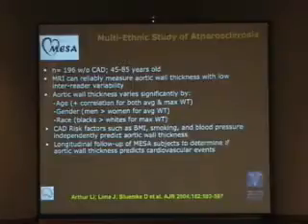So what are the findings? This is now in a setting that you want it to be. This is a multi-center setting, looking at subclinical disease, 196 patients, 45 to 85, showing that it's not only New York and Seattle that can do this, that MRI can reliably measure aortic wall thickness with very low inter-reader variability. And there's a wall thickness correlation with age, and it's interesting also with gender and race. That's one of the important points of that study. But also that CAD risk factors such as BMI, smoking, and blood pressure independently predict aortic wall thickness.